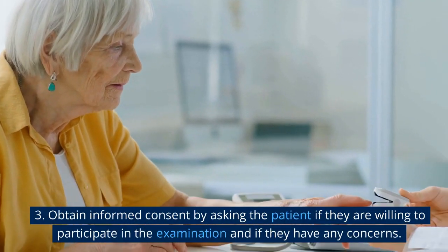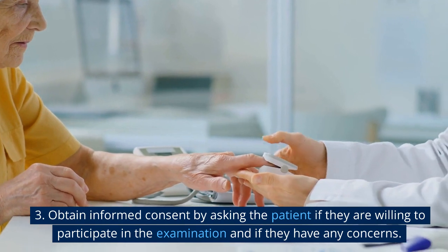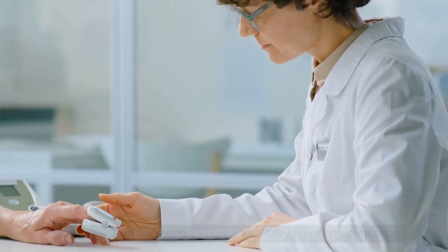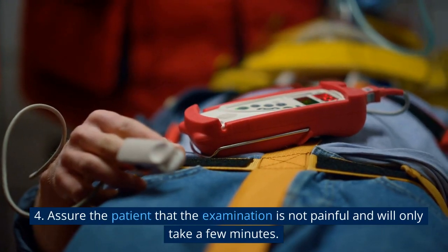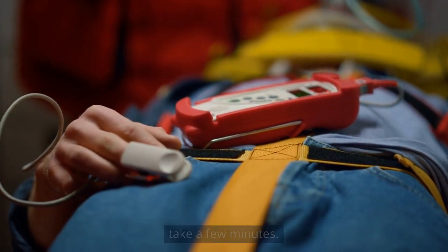Step 3: Obtain informed consent by asking the patient if they are willing to participate in the examination and if they have any concerns. Step 4: Assure the patient that the examination is not painful and will only take a few minutes.